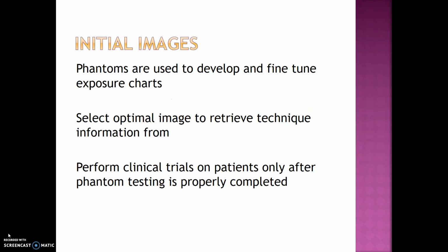Phantoms are used to develop and fine-tune exposure charts. They select the optimal image to retrieve technique information from, and then perform clinical trials on patients only after phantom testing is properly completed.